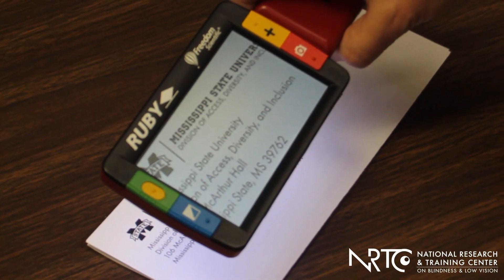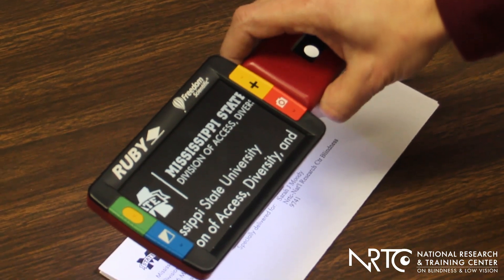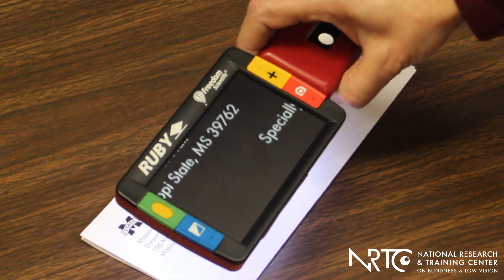You can also adjust the color of the image that is displayed. For instance, this page that's white with black letters on it, you could view it in that same way, or you could reverse the colors so that the background is black and the letters are white.